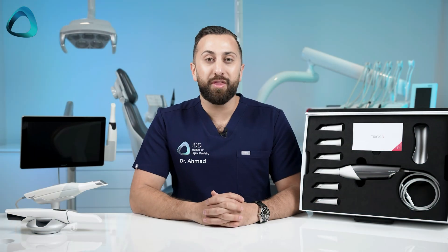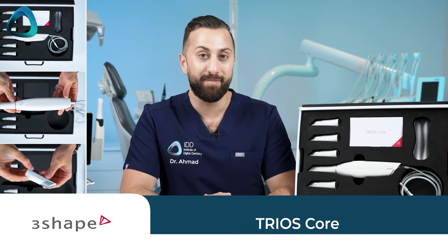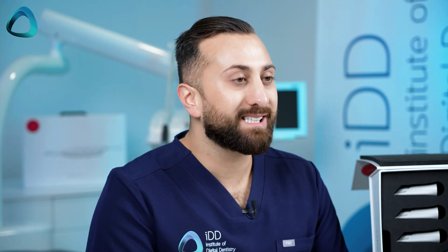At the recent 3Shape Discover event, we had the release of two intraoral scanners from 3Shape: the Trios Core, which I have covered in another video, and the updated Trios 3, which I have here with me. So this is the updated Trios 3 — let's start with the scanner.